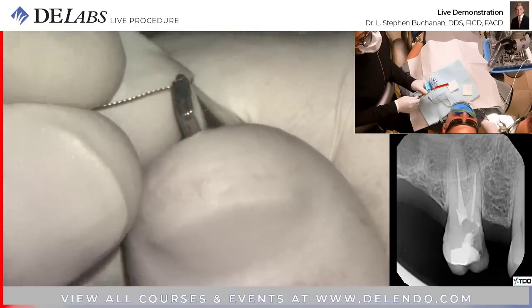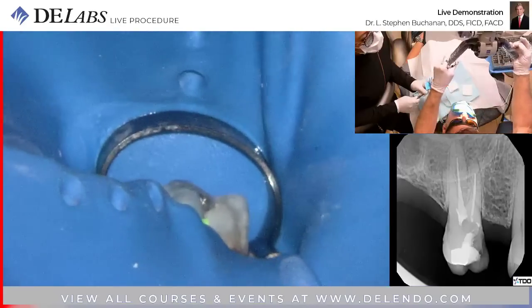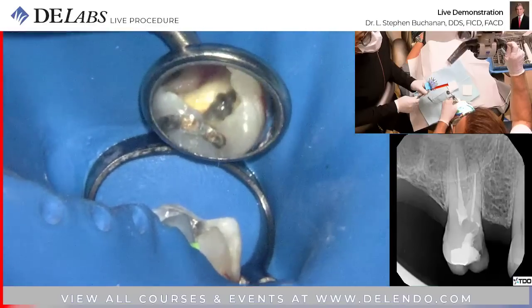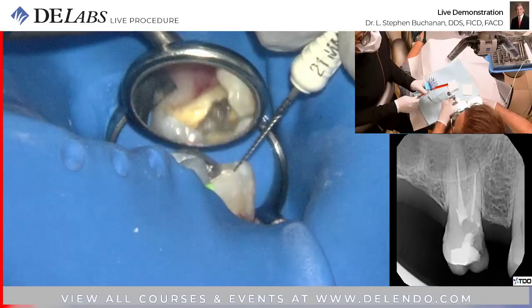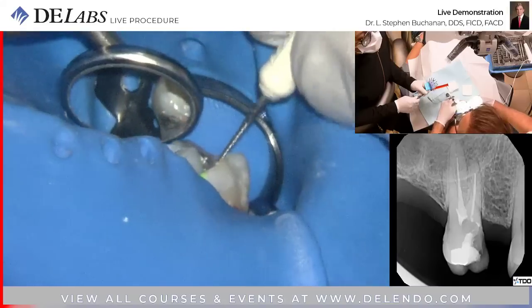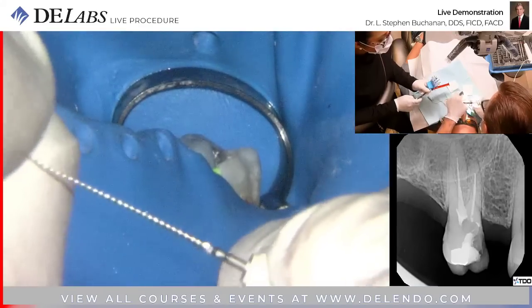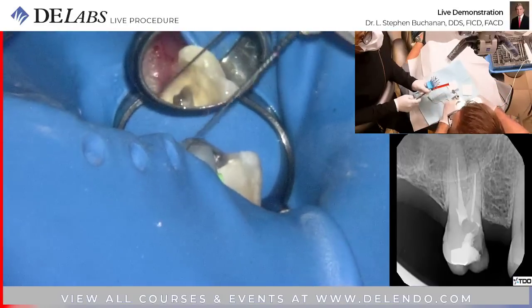A little bit too much. So you put the bent part to the mesial to get in the orifice. And I'm using a 15 here.